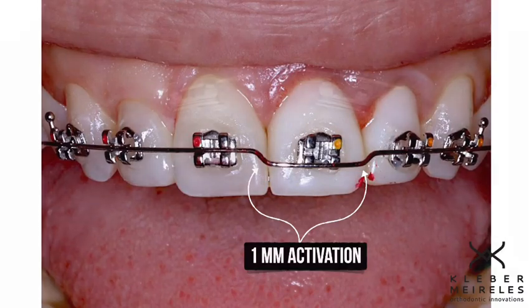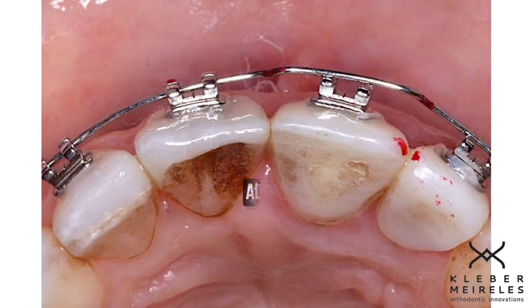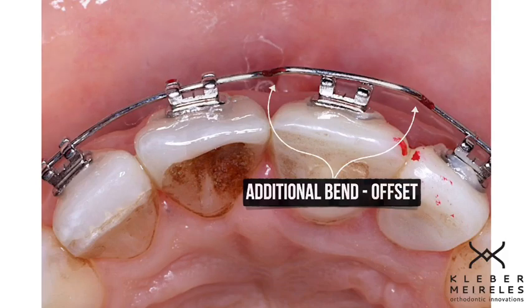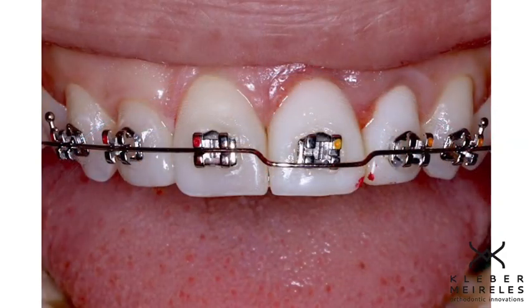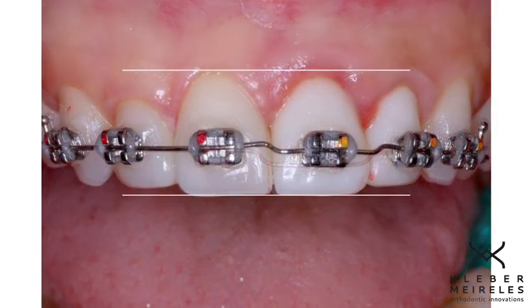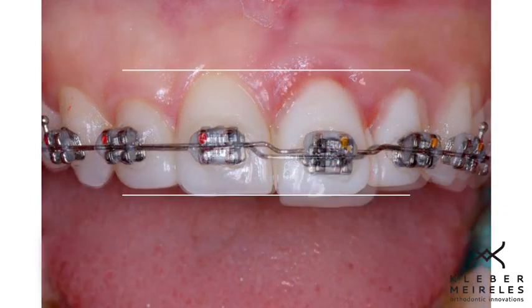And this is the bend — one millimeter step down bend plus one millimeter step forward, or offset bend, to control the movement of the incisor, avoiding the inclination of this crown towards palatal.